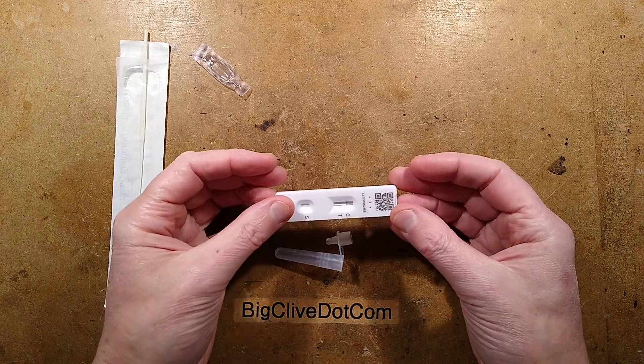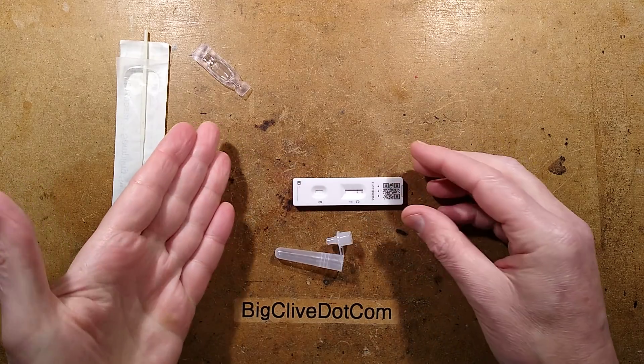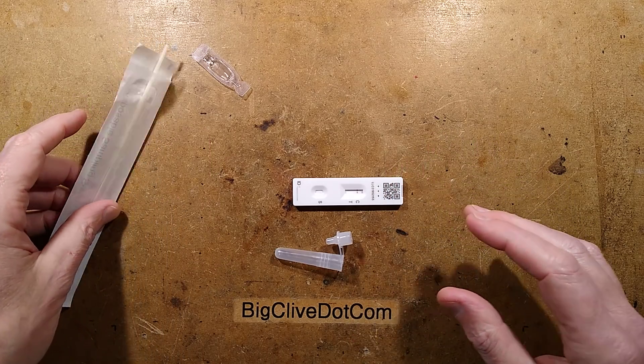However, I thought that these were quite interesting, so I've found out how they work and I'm going to explain how they work now. I'm also going to explain how the test is done.